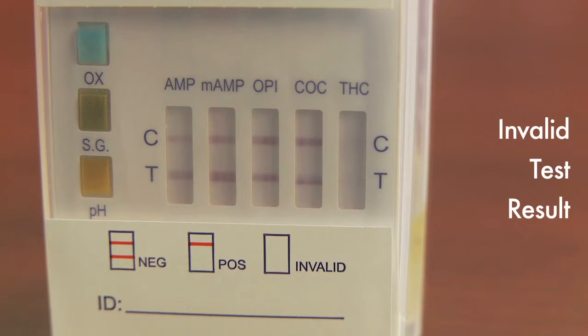In the event that a red line does not appear in the control region, the test may be invalid. This may occur when an insufficient amount of urine has been collected. If this occurs, discard the test, review the process, and administer the test again. If the problem persists, contact your service provider immediately.